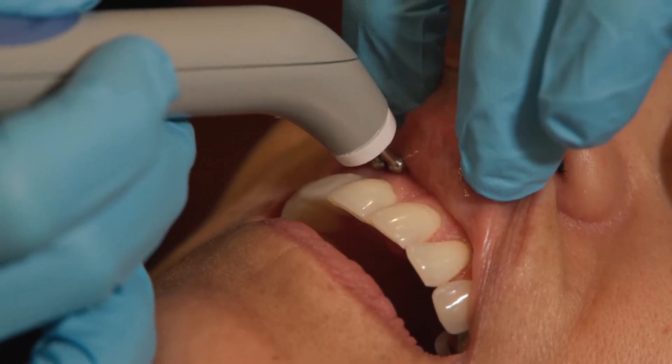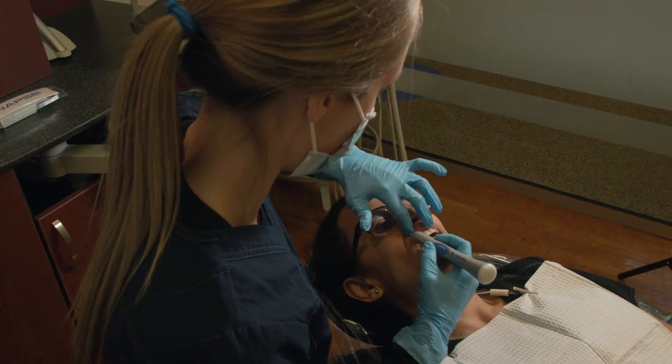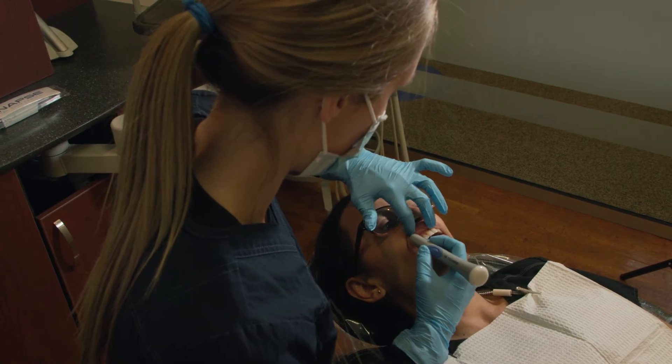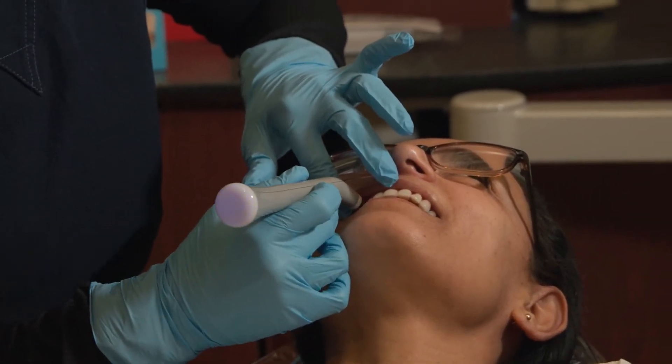Just the ease of use makes it a very essential part of my armamentarium — if I need it, it's right there and I can use it. It's comfortable for the patient and it's effective. At the end of the day, that's what we want: the product to be effective, and that's exactly what it is. It works. It works well.